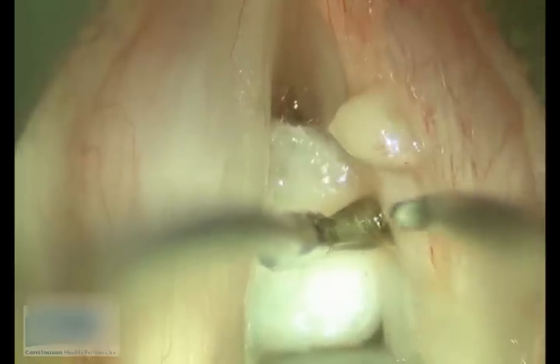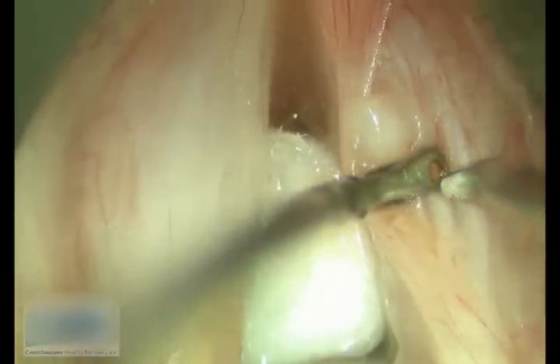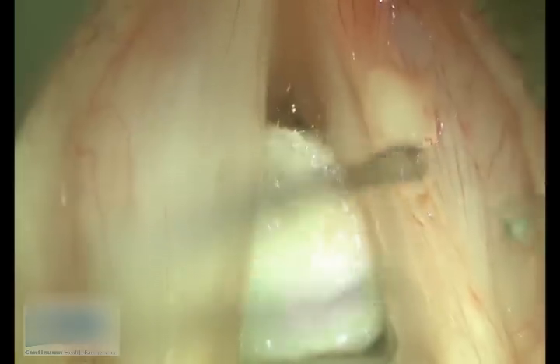Care is taken throughout the procedure to protect the flap and vocal ligament from injury. This helps minimize post-operative scarring and ensures the best operative outcome.